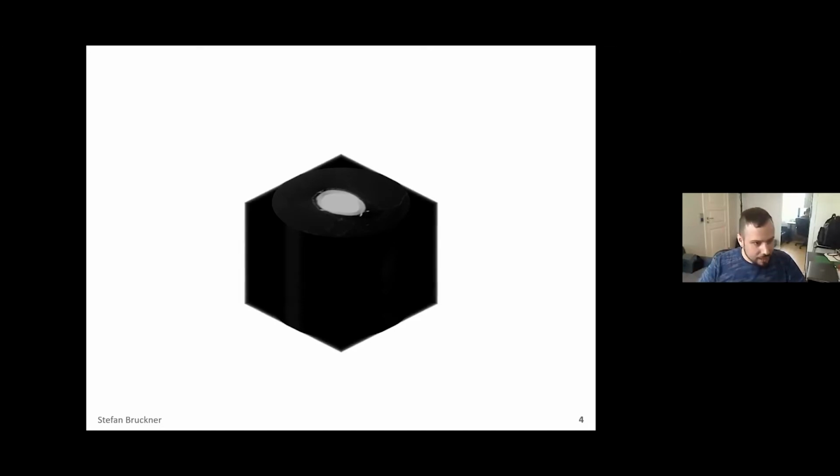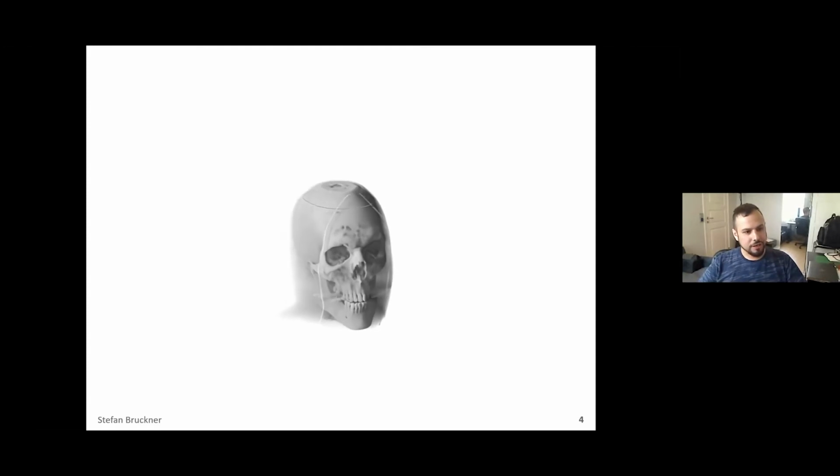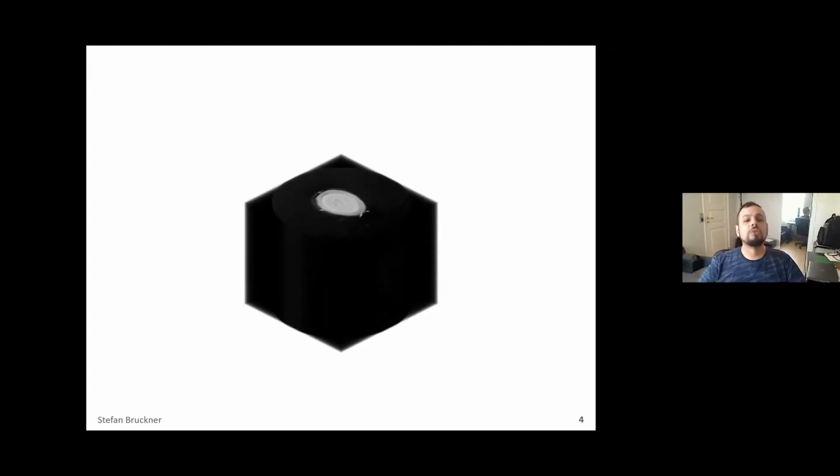And then we can actually start to really look inside the data and, for instance, create this kind of semi-transparent 3D visualization from our original volume data. So that's sort of the pipeline that we will be looking at in a bit more detail here today.